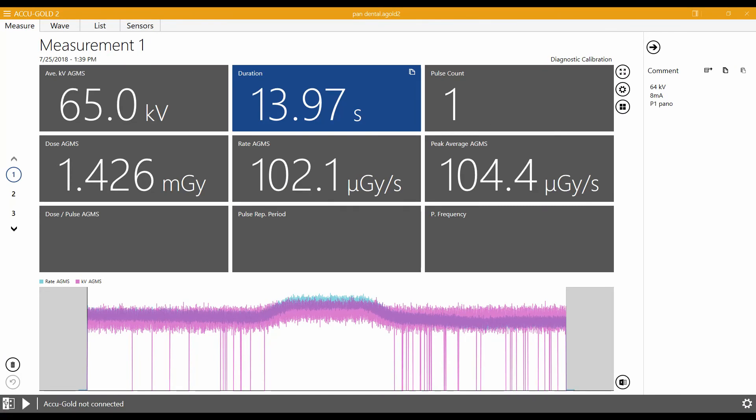Some waveform distortion is normal due to the low signal level associated with this type of exposure.